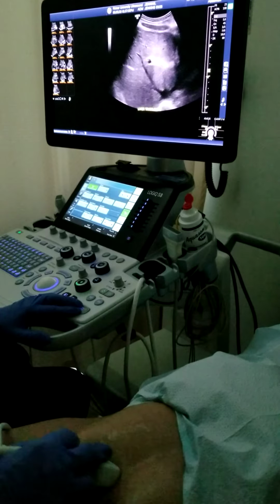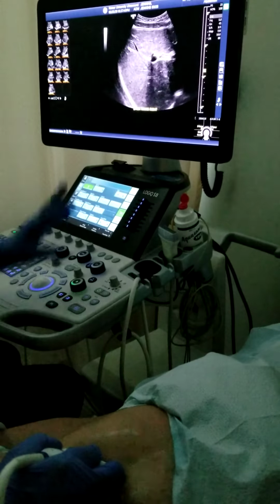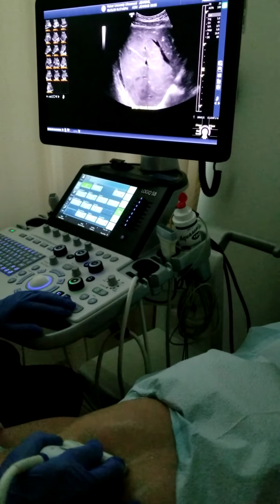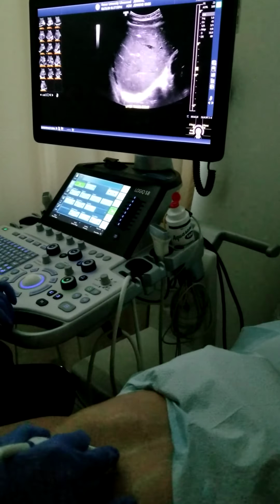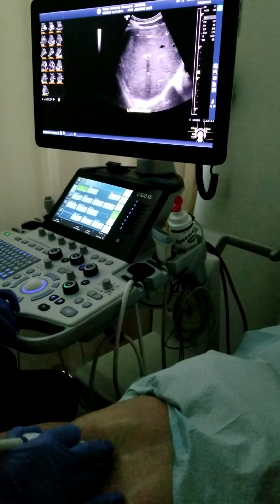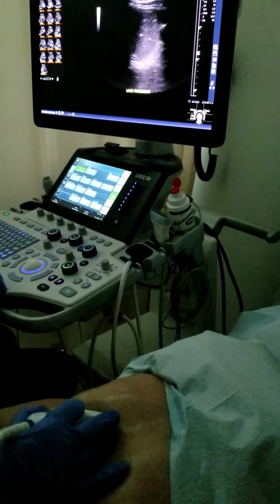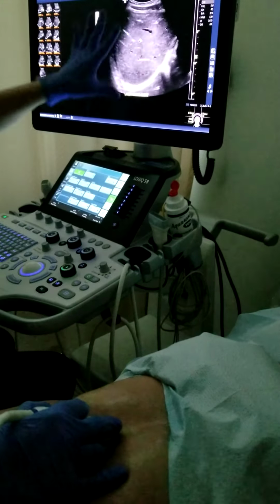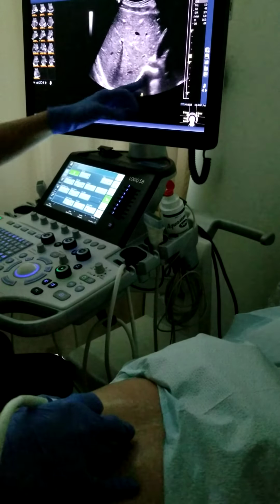All right, so remember, as sonographers, we're not only taking pictures that highlight certain anatomy, but you also have to be looking at each organ for any pathology. Take another breath in. So if I'm scanning this patient, after I take my pictures that I need, I'm not going to worry about my left hand so much, and I'm just going to start moving my probe, sweeping through the organ, assessing it. I'm looking at the parenchyma. Is it smooth? Are there any masses? Are there any cysts? I'm not only looking in the organ, I'm looking around the organ. I'm looking outside of the organ.